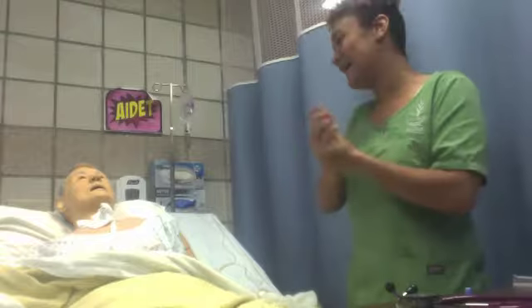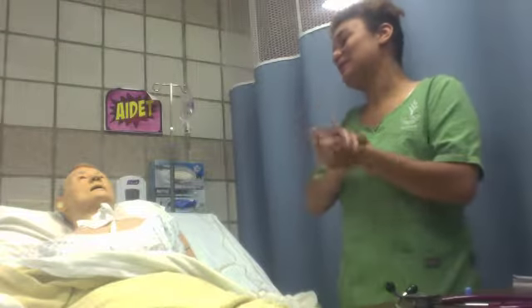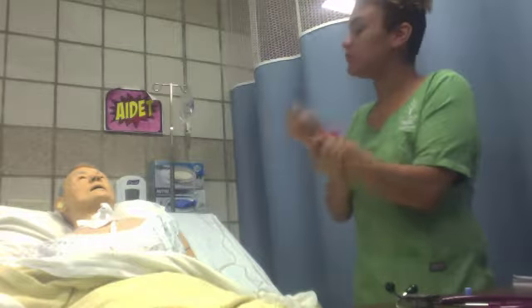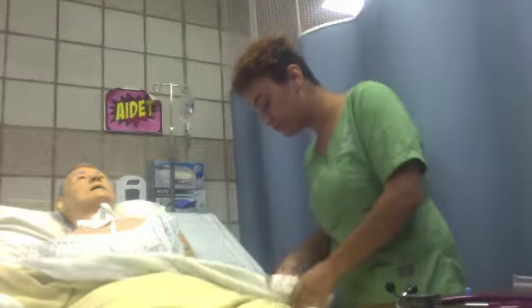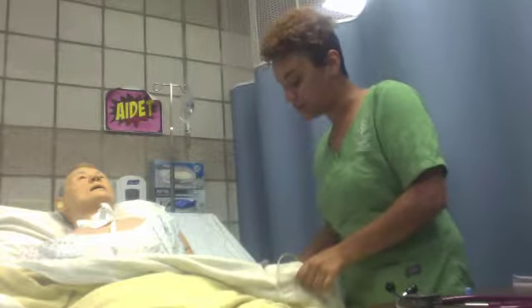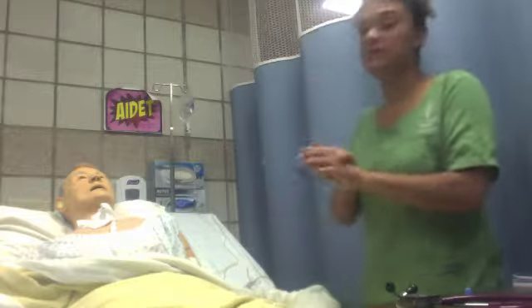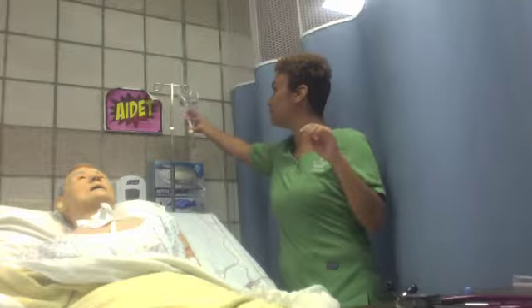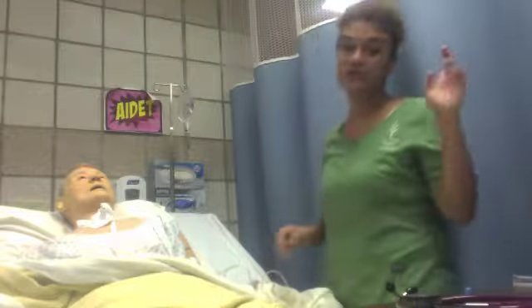I'm going to knock on the door, and then, hi, my name is Desi. I'm your nurse today. So I will be checking your IV site, but before we begin, can I get your name? And your date of birth? Okay, yes. Thank you. So I'm checking that with not only what's on the bag, what's on the wristband, but also with the computer.